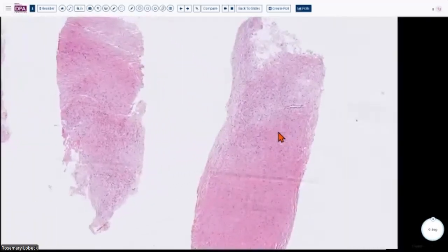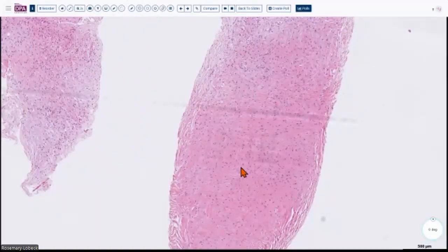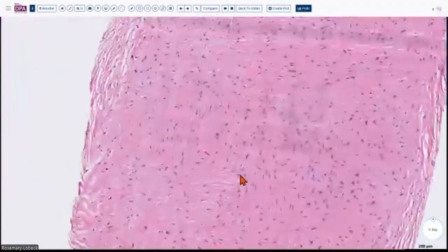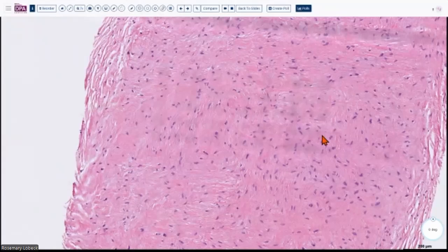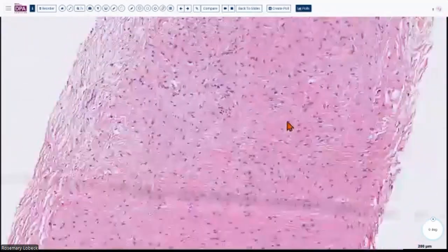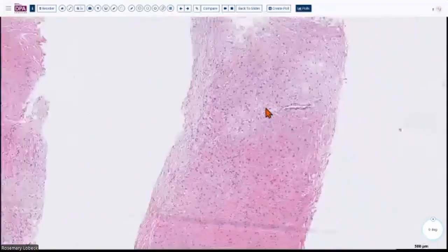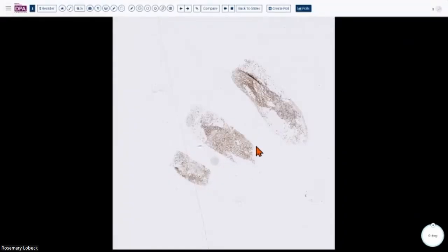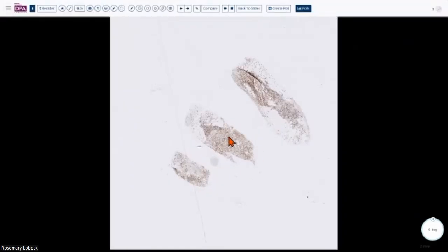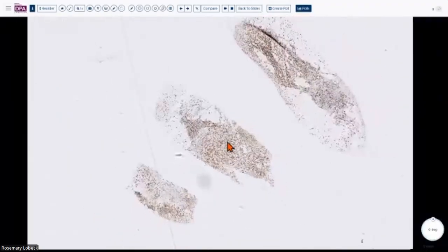On this needle biopsy, we can see, again, very similar features to the last case, even lesser cellularity. So it's so bland, you're basically thinking of, okay, is this some kind of cellular area from the periphery of a myxoma? Is this some kind of fibroma, maybe a neurofibroma? Or maybe they just missed a lesion and went tangentially through into the capsule. So all these are going through your mind, but again, now you know what this lesion is going to be. When we do the MUC4, it's strongly and diffusely positive. So this is another case of low-grade fibromyxoid sarcoma.